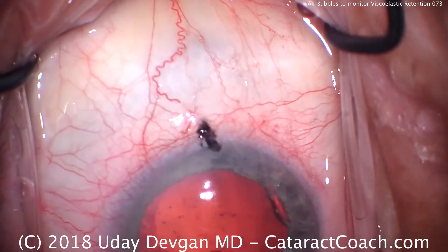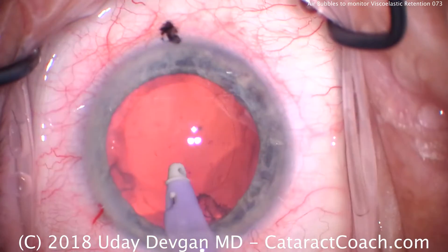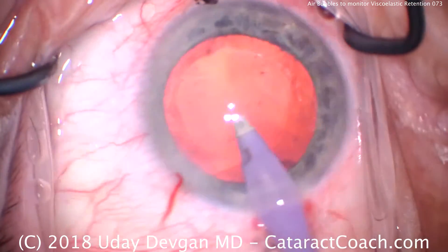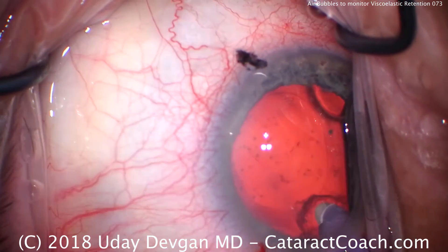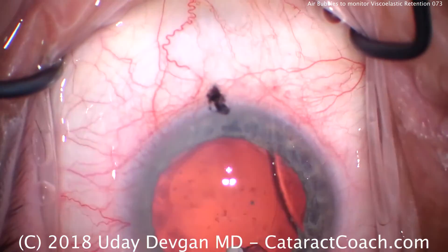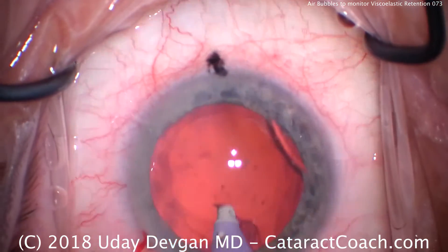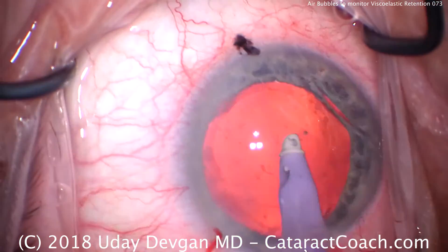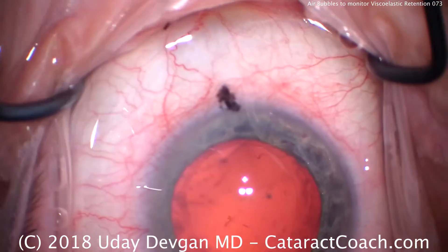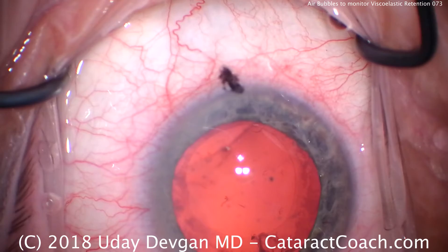We'll adjust the lighting so you can tell. There's that last bit of subincisional cortex — you saw that grab at the posterior capsule; we let go very quickly. The subincisional cortex is a little tougher to remove. There is also a strand of mucus on the surface of the cornea that we should wash off. The black dot at the limbus is just to mark the steep axis.